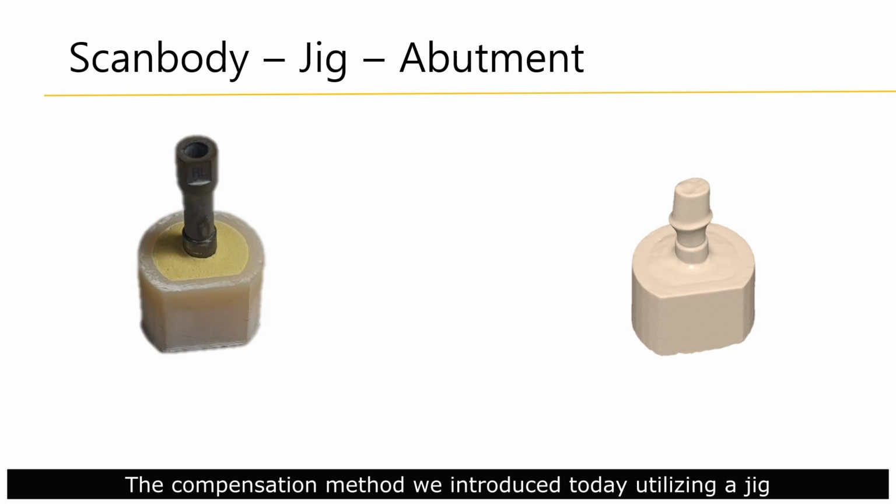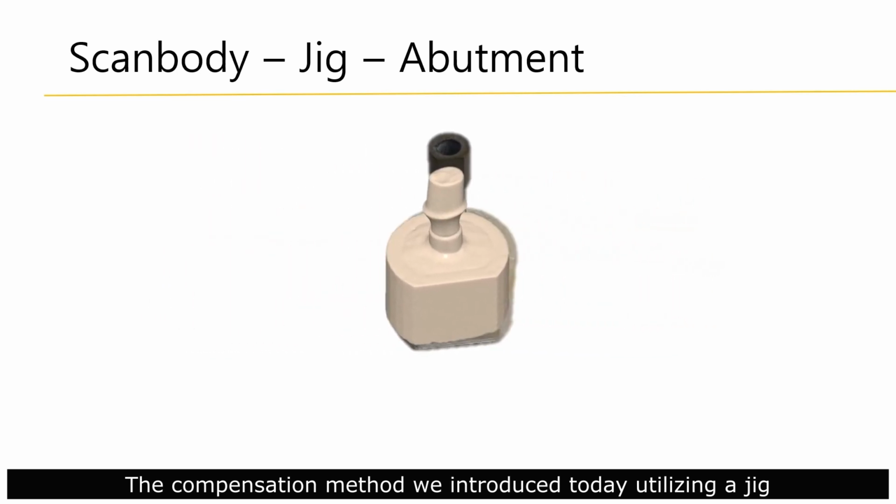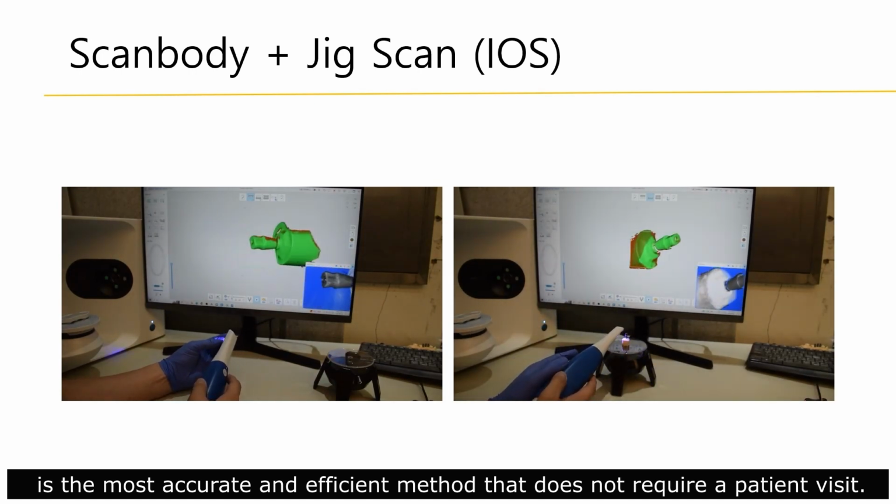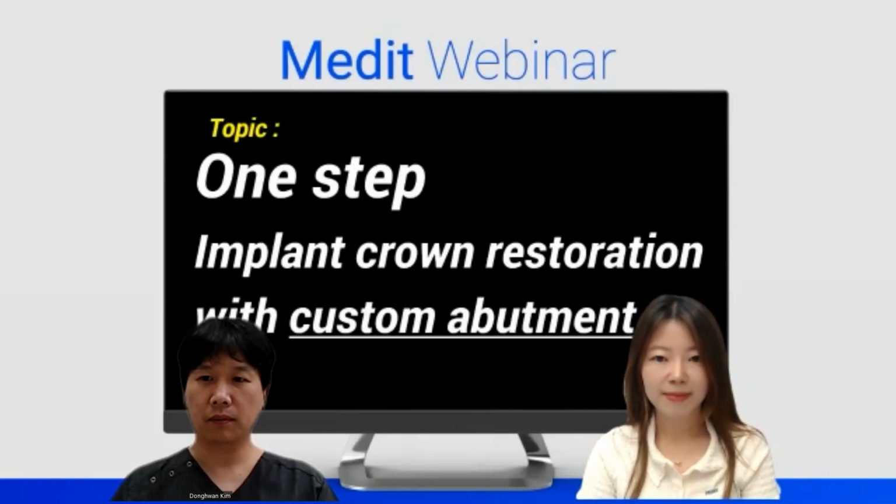The compensation method we introduced today utilizing a jig is the most accurate and efficient method that does not require a patient visit.